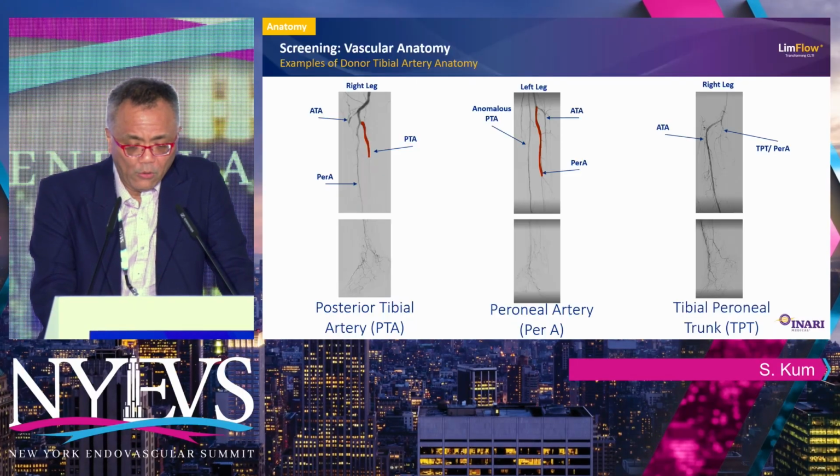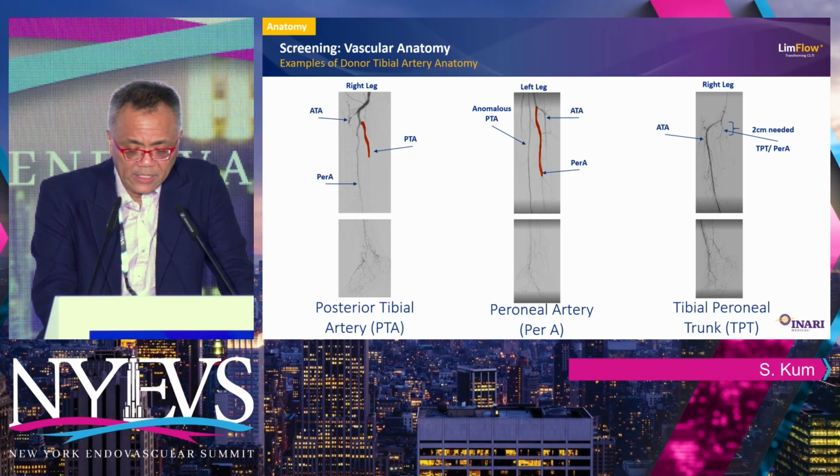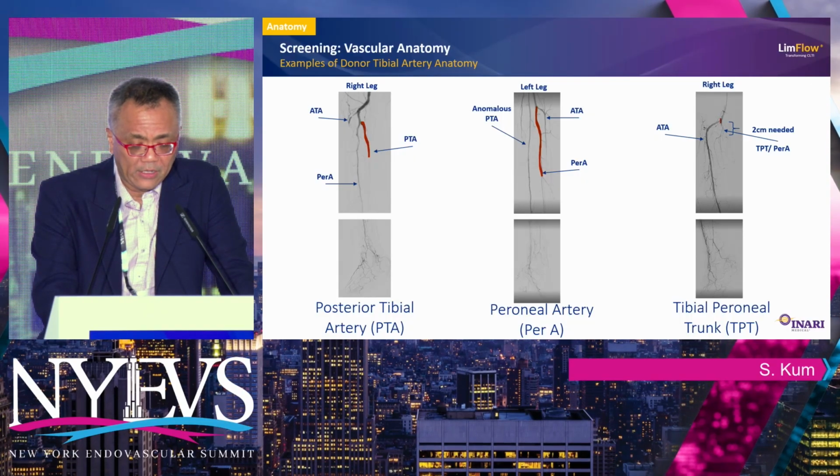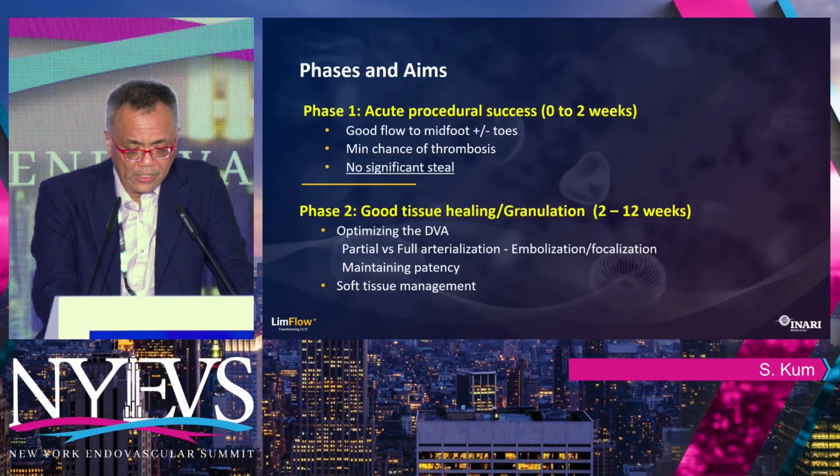Another case with the AT going with the trunk occlusion. This is a classic case where you add blood to the equation, not by stealing blood from the existing anterior tibial artery, and then do the procedure and get blood to the foot.